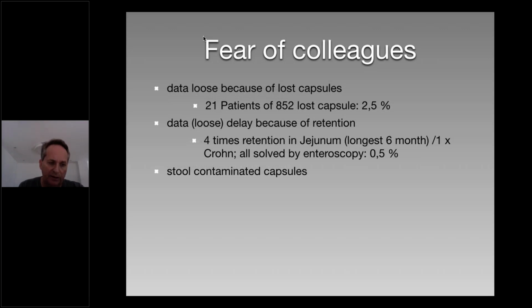Another fear is stool contaminated capsules. And I can guarantee you, you will get back the capsule totally clean. The patients will be ashamed if they bring you back a capsule with stool. You get it clean. Patient acceptance is also really good.